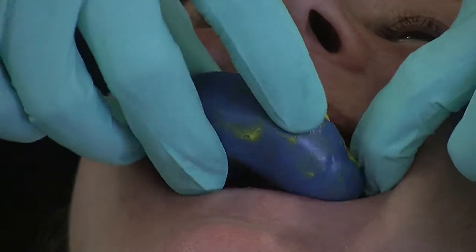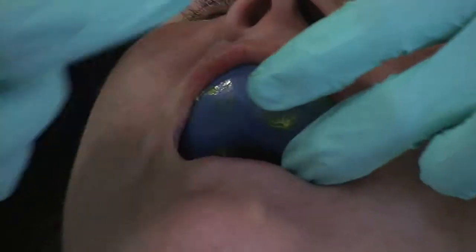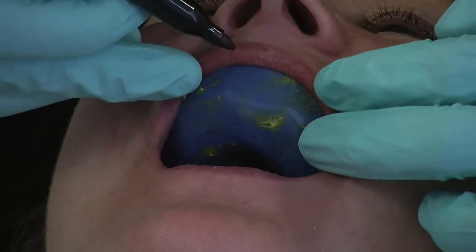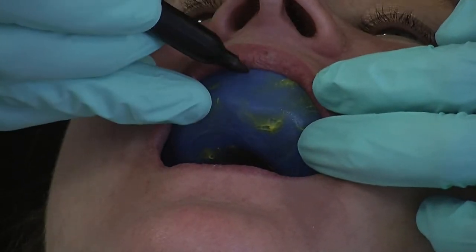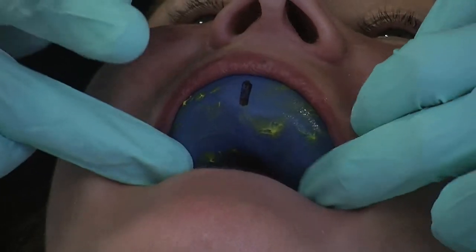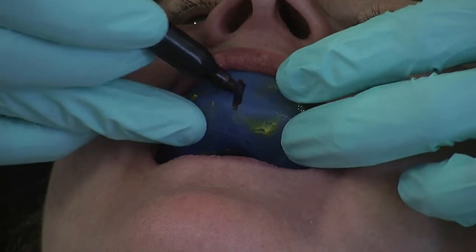So I'm just going to bring that round here. This is from the wax ups. That sits in nice and snug. Another great little tip is just to mark the midline of the face onto the index, so that when I'm seating it properly live from behind the patient, I'll know exactly where to place it or the angle it's in.